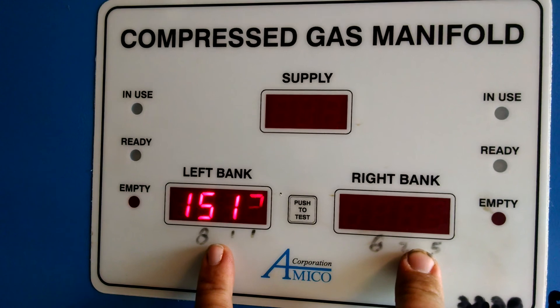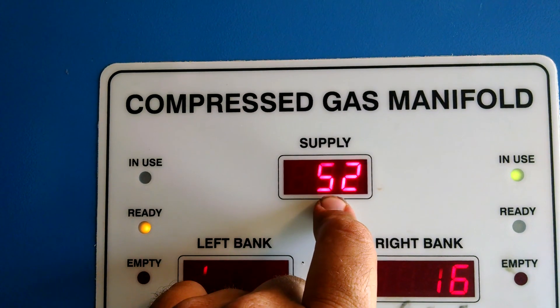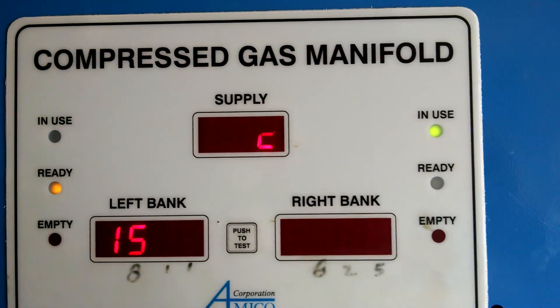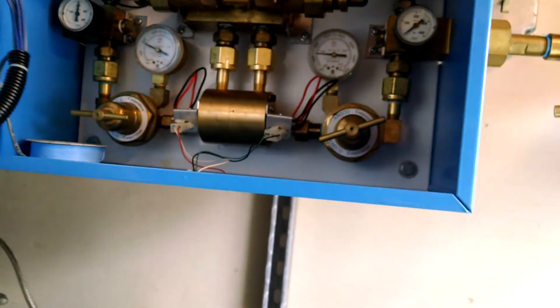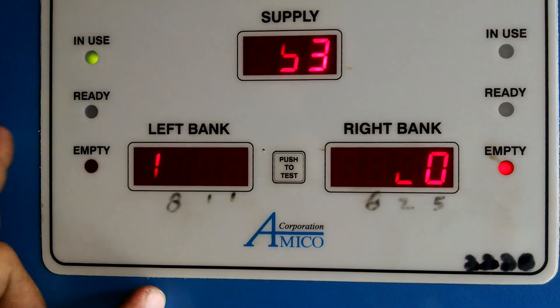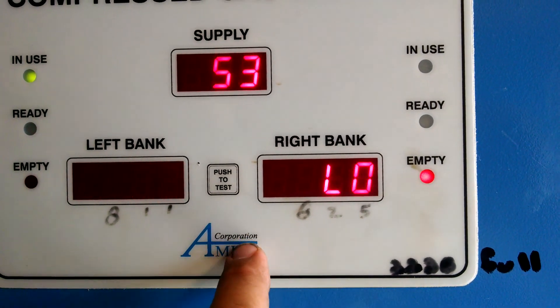I'm guessing in a real world situation it still has 52. So once they deplete this again, it'll switch back. So it'll be pulling off of the left bank, but it's wasting a lot of oxygen in between.